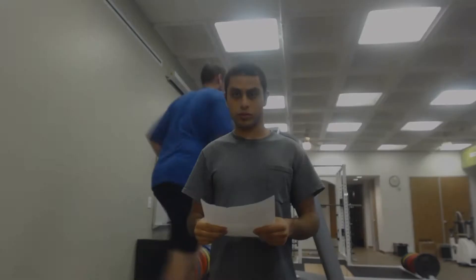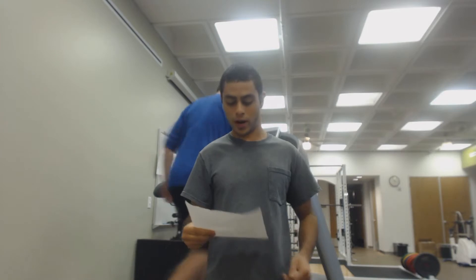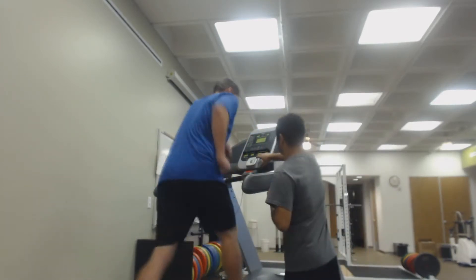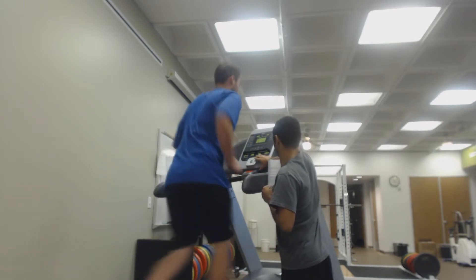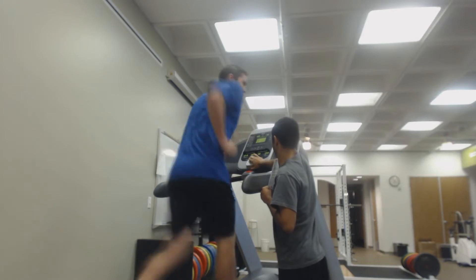Stage five: he's going to go 5.0 miles per hour at 18% grade. My heart rate is 190.